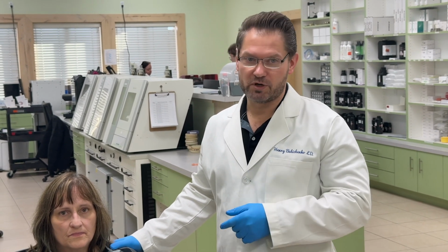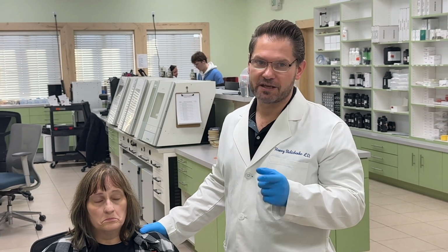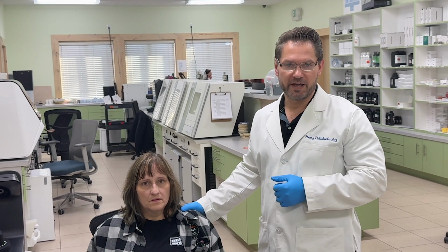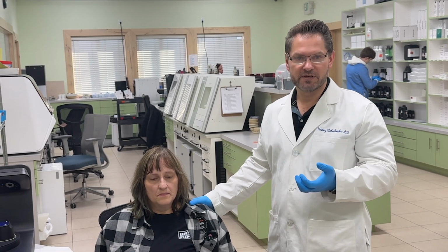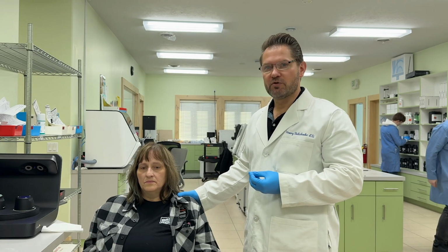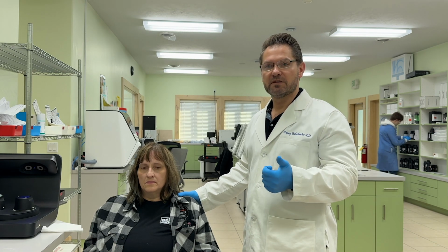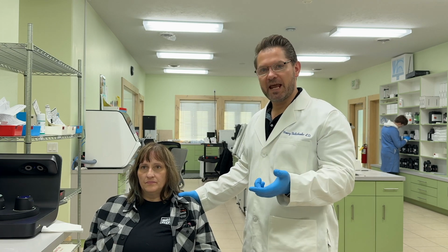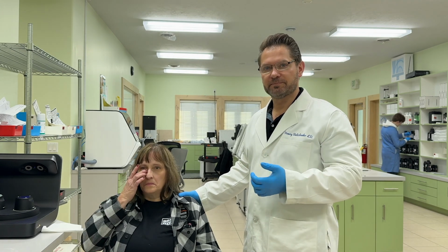Or one of the best workflows, if the patient already has existing dentures, you use their existing dentures to take an impression. Just a wash impression of an upper and lower denture and a bite. This way, the patient is already accommodated to their previous dentures. So when you take an impression of their existing denture, you will get a bite, you will get a position of the patient's teeth, and then you can improve on it. So let's move into how to take a triple tray impression to construct digital dentures.